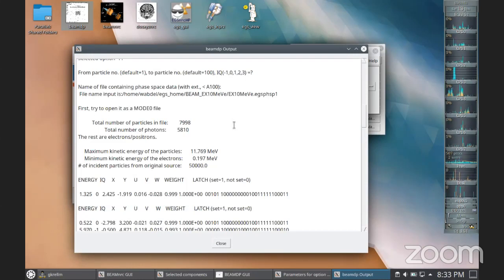They have low energies. We can go and look at the spectrum. So don't be fooled. For example, you run the simulation, oh, I have 10 million particles. But most of these are just photons, actually. 80% are, 70% are photons, okay? And probably you want to actually have the photons, but their contribution to the dose is not going to be significant because most of the energies are going to be low.